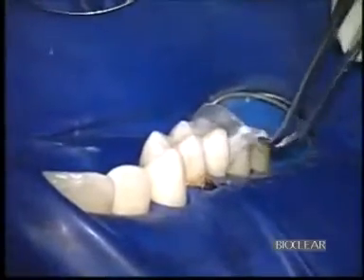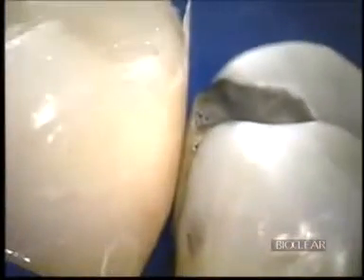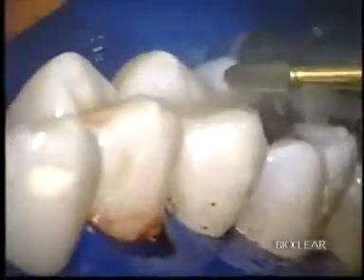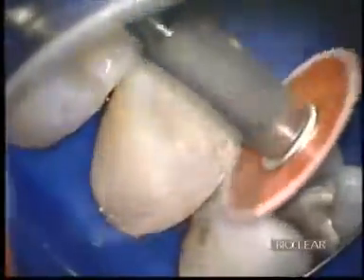For the first time in a Class 2, the entire system is translucent, so we're going to get through and through curing. The contact is generally far too tight to be able to pull the interproximator out through the occlusal. Many of the details of finishing and polishing are explained carefully in the long version of the Dentiform video that you'll find later on in the menu.